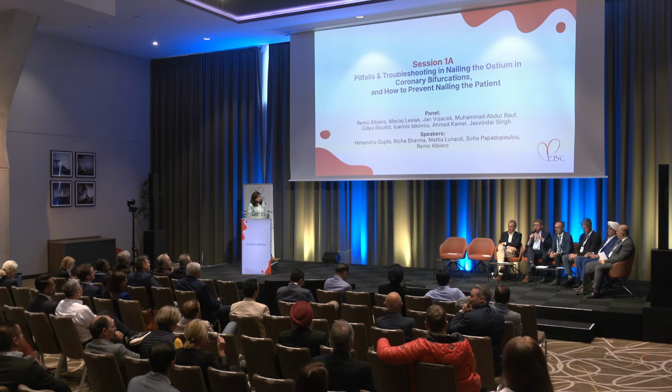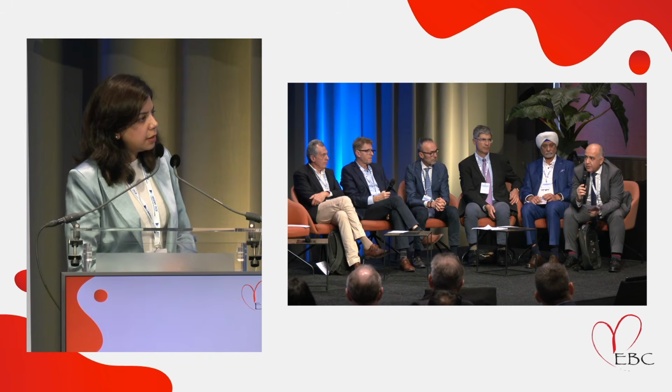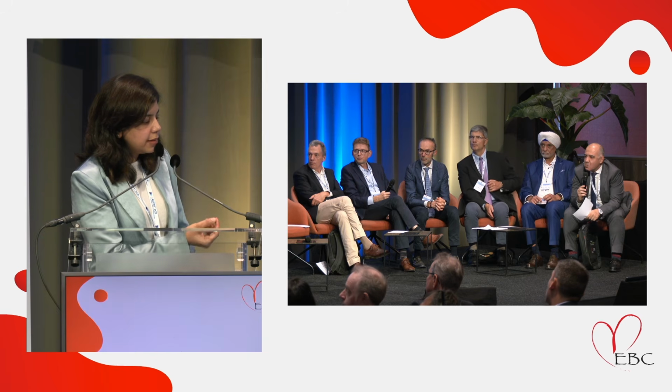Okay, so now we have a few minutes for discussion. Any comments from the panel, please? I think you're very smart. You used one stent, and you got benefit from the overhanging stent in the left main. The old stent, you got much benefit from this maybe mistake by the other operator. So that's the advantage of actually doing this as a stent Culotte.